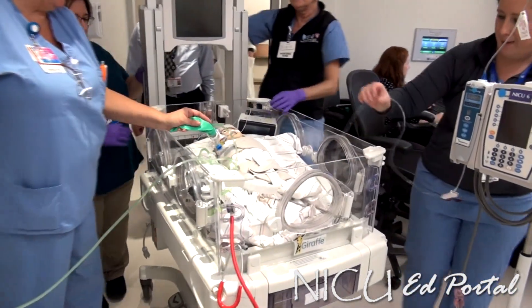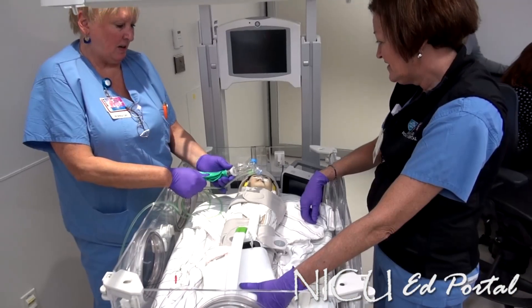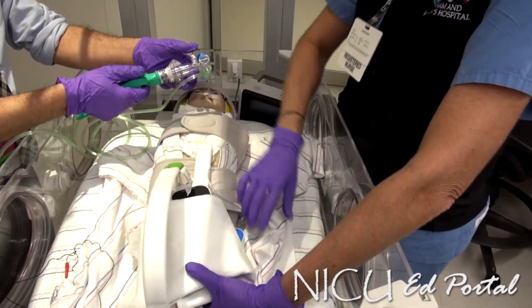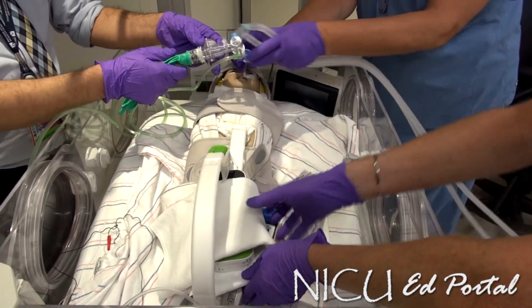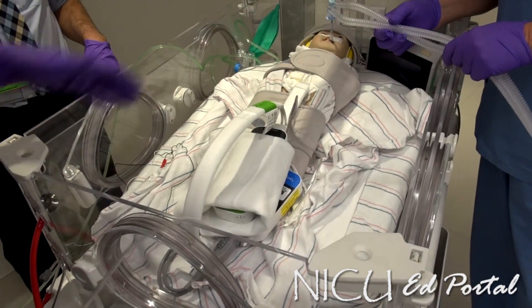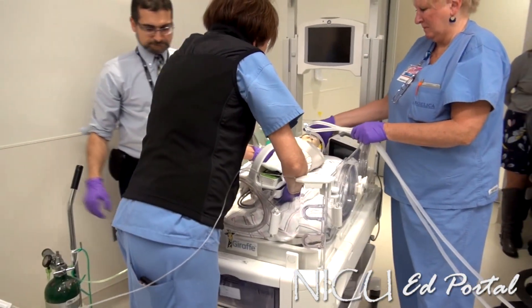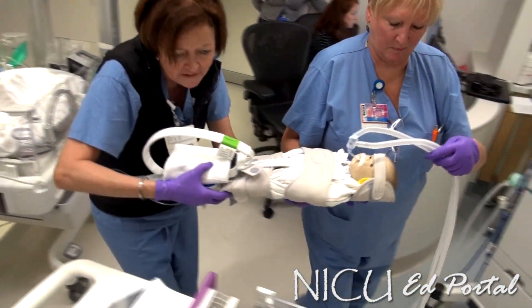Muhammad, would you take over the bag while I get the ventilator? Both the cardiac monitor and the SpO2 monitor actually go into the scanner with the baby. Cindy's going to have her ventilator on the left-hand side. When I move with the baby, could I ask you to move the IV pole to the right-hand side of the scanner? We're still on the monitor — heart rate is good, SpO2 is good, and we're coming over to the scanner.